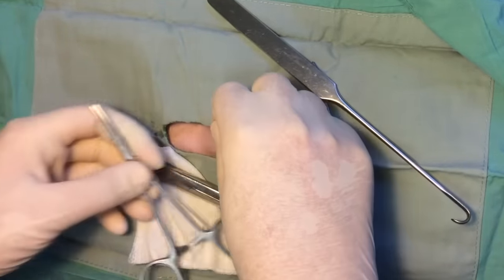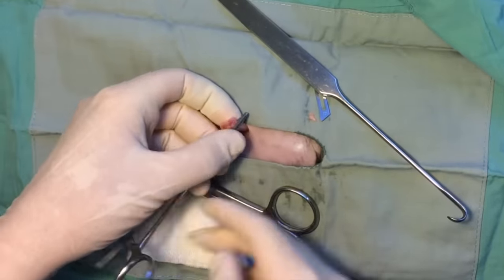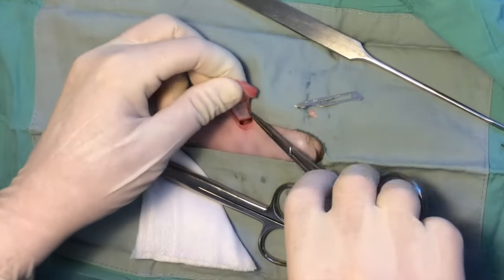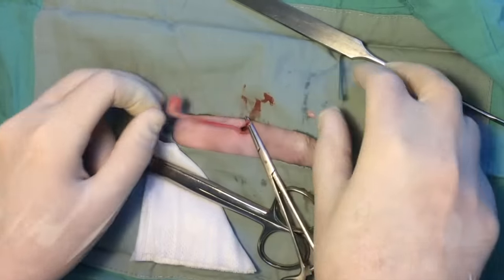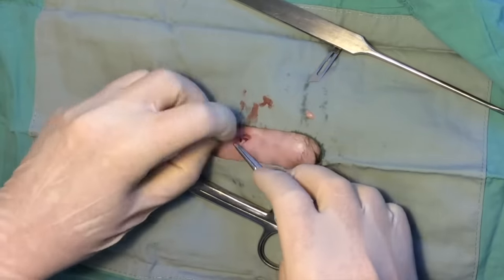The uterus is exteriorized and the horn is followed cranially to the ovary. A window is created and the proper ligament is clamped. The suspensory ligament is isolated and is cut with a scalpel blade. The pedicle is ligated using a pedicle tie technique. After tying, the pedicle tie is tightened with the fingers and is allowed to return to the abdomen.